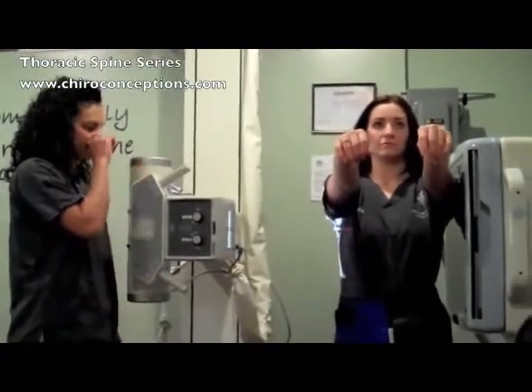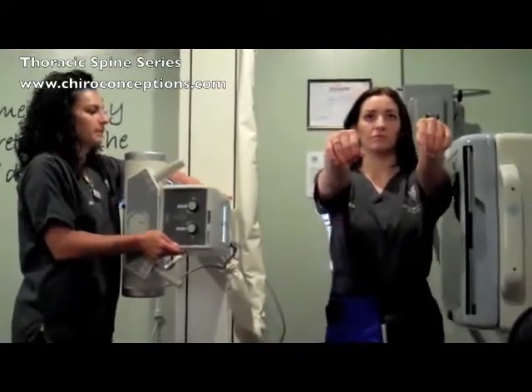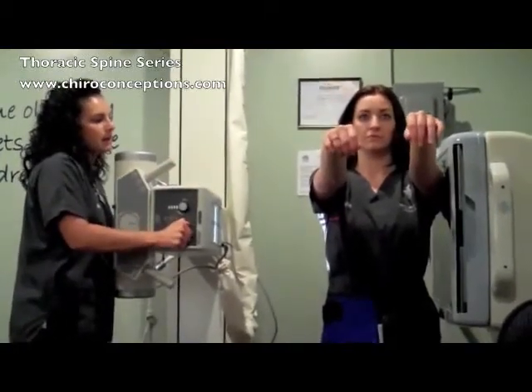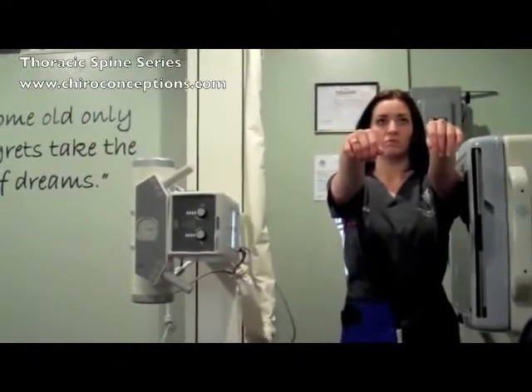Just line the patient up forward and backwards, and just a step forward. You might have to turn your tube so that you can go at the angle of the spine. And you want to do this on just breathing normal, so you can blur the ribs out.